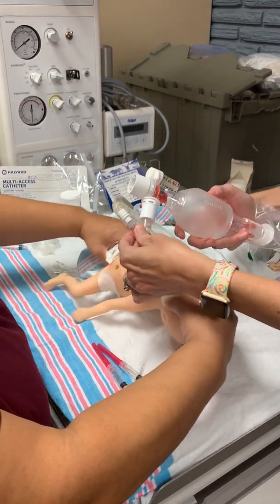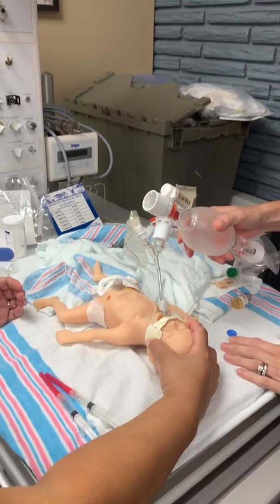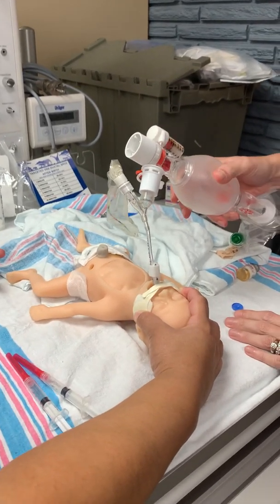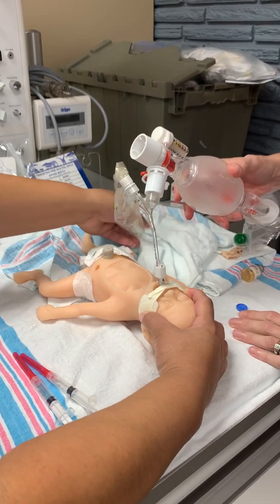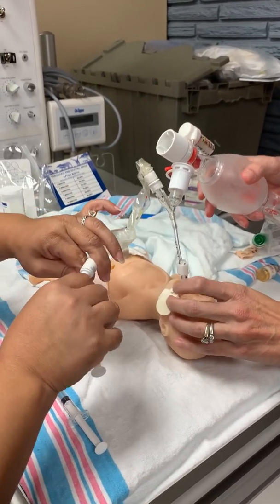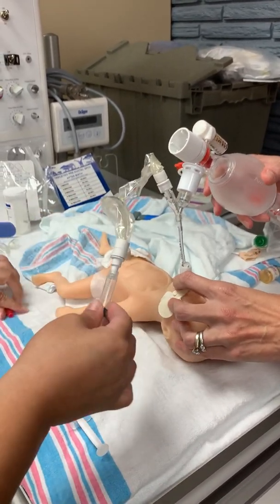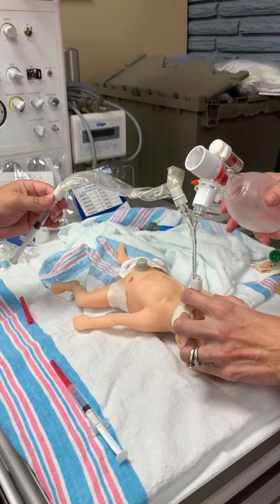Okay, so we are bagging the infant, making sure that our saturations are appropriate, making sure that our heart rate is appropriate. We're setting them up for success. And now I'm going to go ahead and attach my first syringe, make sure it's luer locked appropriately. And now I'm going to give my first dose.